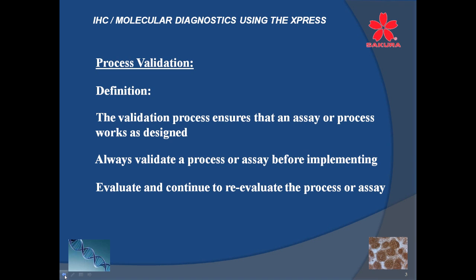But one point I might make here is that many of us have used a tonsil for an IHC control, for CD markers, or anything that we could use that type of tissue for. But all tonsils are not created equal, so to speak. So we need to really validate a process and assay before we implement it, not just, well, I'll just use this tonsil today, it'll stain for CD3. It may not. All this needs to be tested. And so we're in the mode today of testing our materials more than we ever have been to make this preciseness happen very carefully and uniquely in our laboratories.